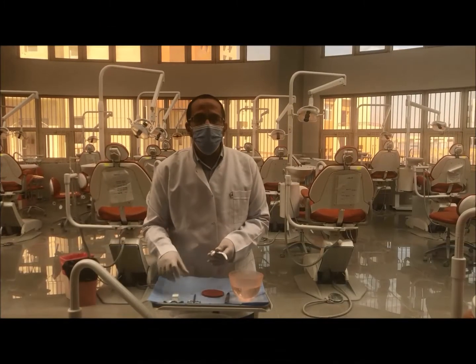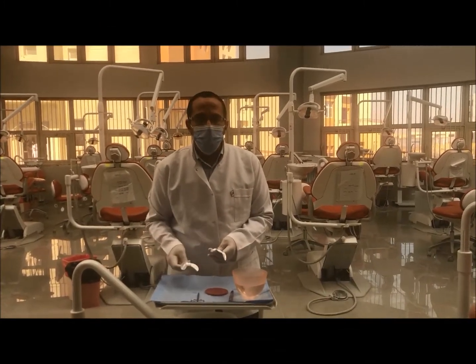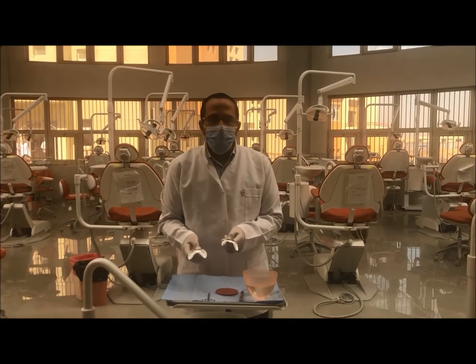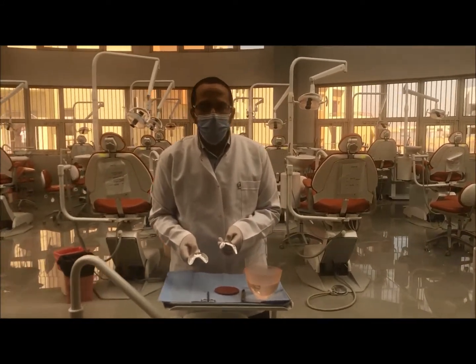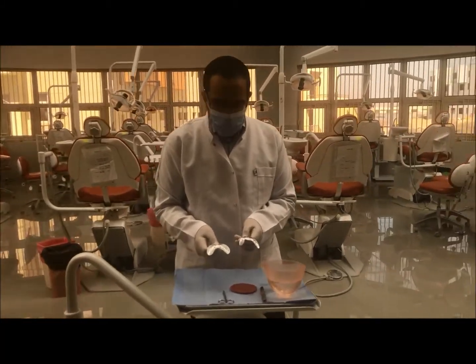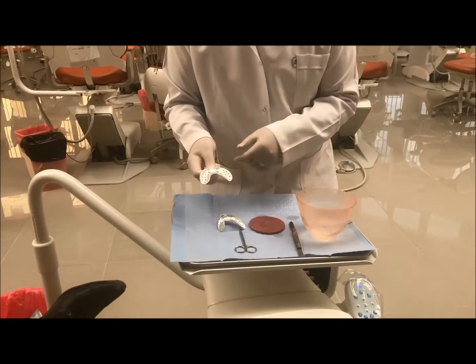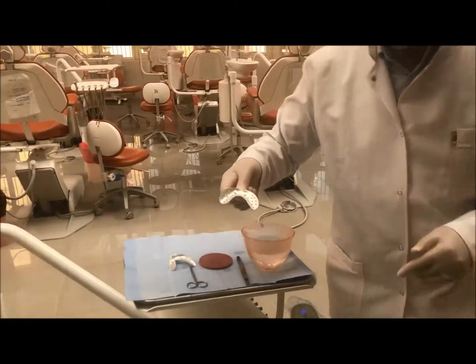Now we are going to make a primary lower impression. We will select an edentulous tray, as we differentiated before. Now we have to choose the size — either size 1, size 2, or size 3. I will start with size 2 to check it inside the patient's mouth.